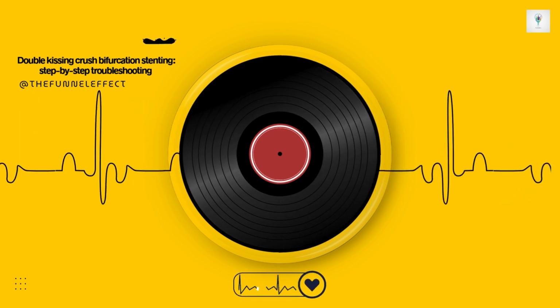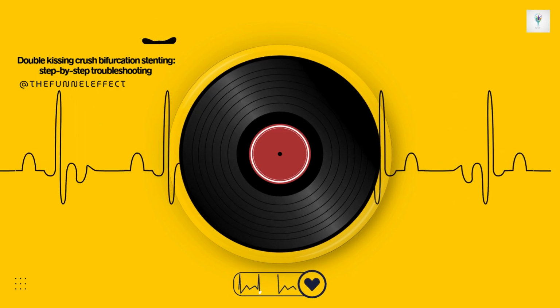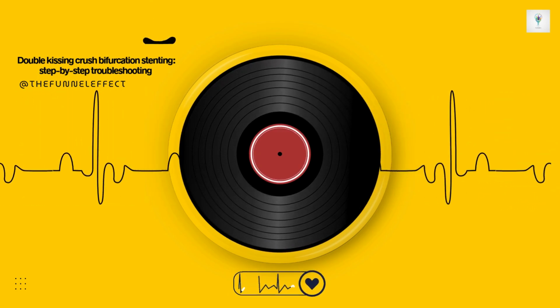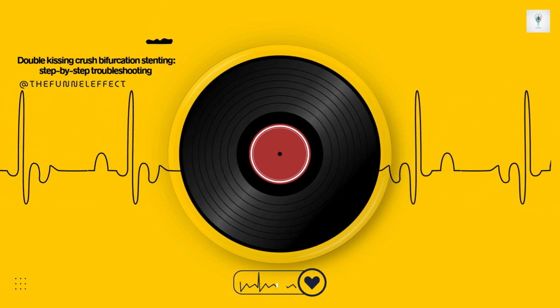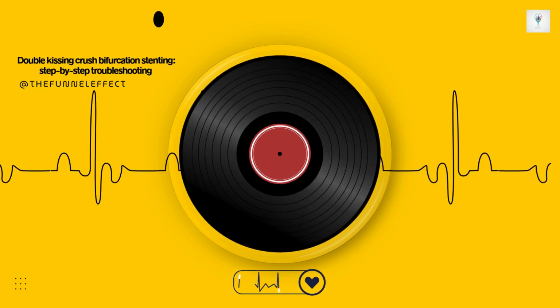There's a technique mentioned, the independent hand technique, that helps with this. You basically use one hand to gently pull back slightly on the guide catheter, countering the forward push, while your other hand makes tiny controlled advances of the stent delivery system. It allows for very precise placement.